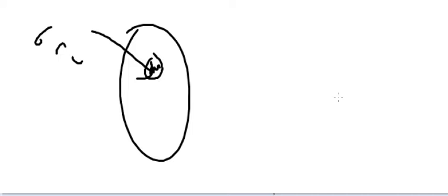Not only that, I can use that to determine whether this stone will respond to lithotripsy or not. If the density is over 1000 Hounsfield unit, it's very dense, it's solid, and it will not respond to lithotripsy, it will not fragment. If the density is 600, for example, or 500, it is not very dense. It will respond to lithotripsy, it will fragment. It's a great idea.